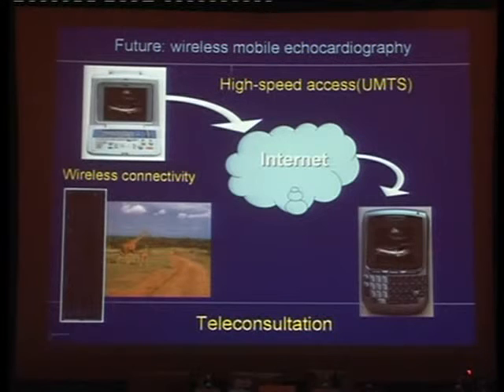And we should not think that echocardiography is real-time strain rate imaging. Most people don't care about that. That's research. Of course, sometimes we get an answer in our management which helps. But the practice, certainly for the third world, is just a simple machine where you can look at a heart, dilated or not, effusion or not, cardiomyopathy, valvular disease, and congenital abnormalities. That's what we need. And the same machine can be used for deliveries, for pregnancy, for major pathologies. That's what you need there, not CTs like they are installing in some of the countries.